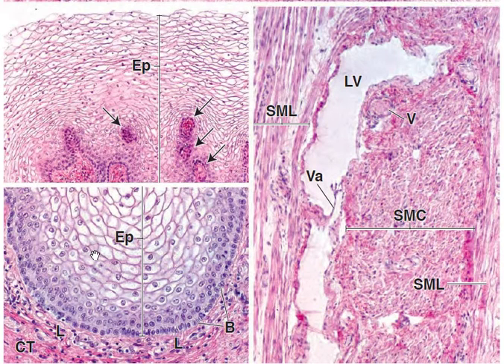This bottom left picture. This is a higher magnification micrograph of the basal portion of the epithelium between the connective tissue papillae. Note the regularity and dense packing of the basal epithelial cells. Right here. They are the stem cells for the stratified squamous epithelium. Just like every other thing we've ever learned, you always have the stem cells at the bottom, and then they work their way up. The outer cells migrate towards the surface and begin to accumulate glycogen as they go, and become less regularly arranged as they go as well.